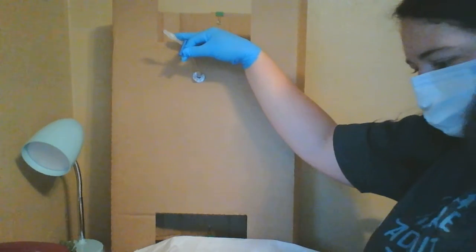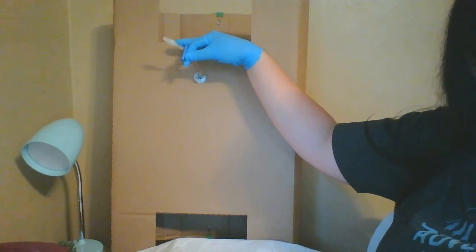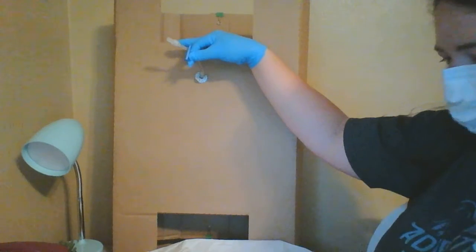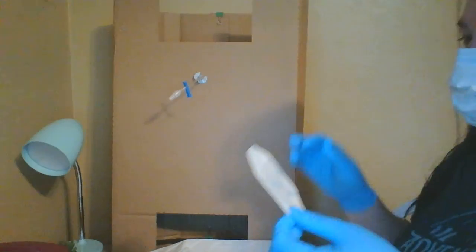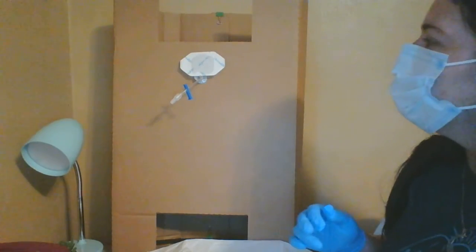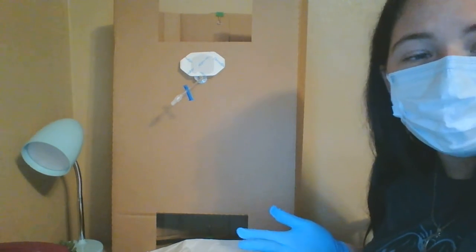And now all I have to do is put on my new label. So here I have my label. Just gonna set that down. Then I would add my new label. Or just pretending. So then once I've done that, I'm almost done with the procedure.